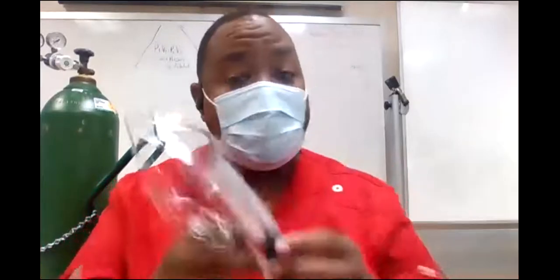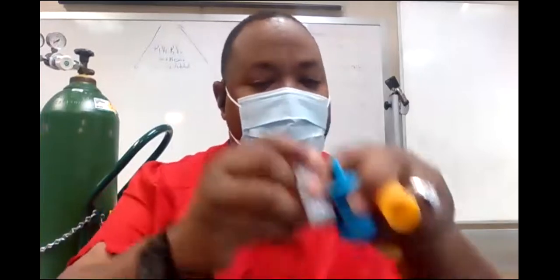And if he's on 40% Venturi mask and he takes it off to eat and drops, then you recommend a nasal cannula at how many liters? 5 liters, okay? All right. So that's a Venturi mask that's pre-made. I'm going to show you one that we make ourselves. You're also going to be seeing these sometimes.